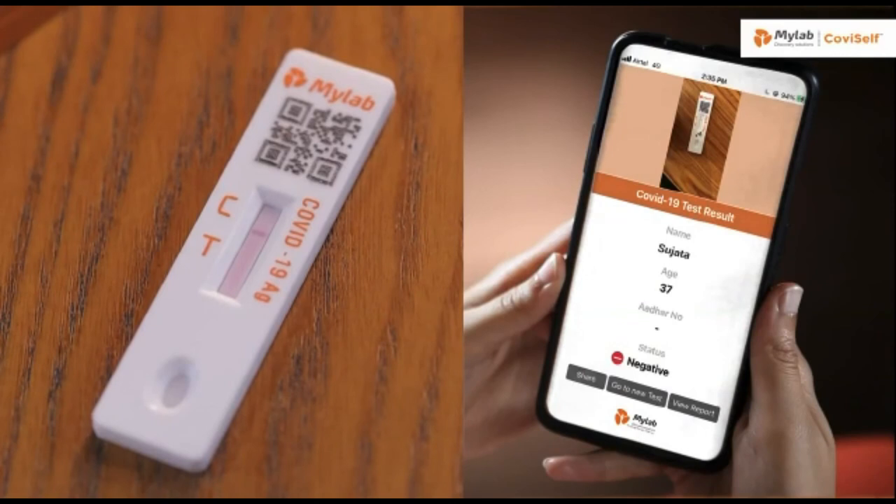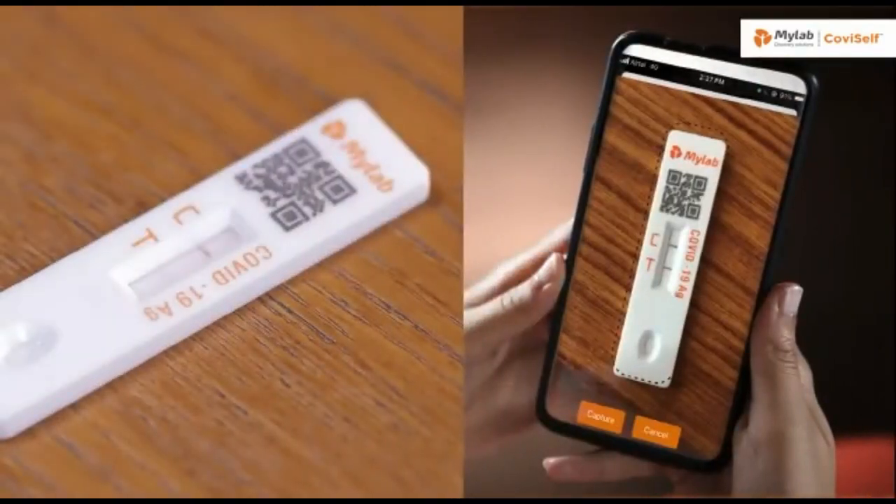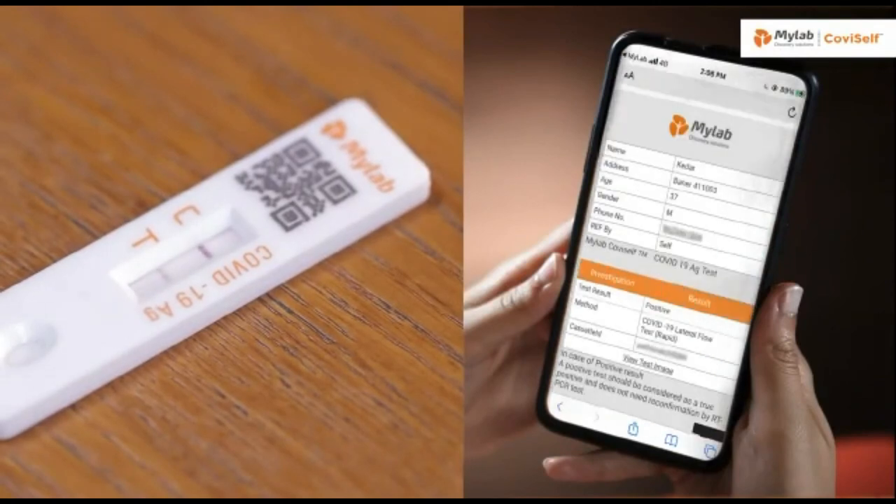For negative results, if there's only a quality control line C and no test line T appears, it indicates the coronavirus antigen has not been detected and the result is negative. For positive results, if both the quality control line C and test line T appear, coronavirus antigen has been detected and the result is positive.